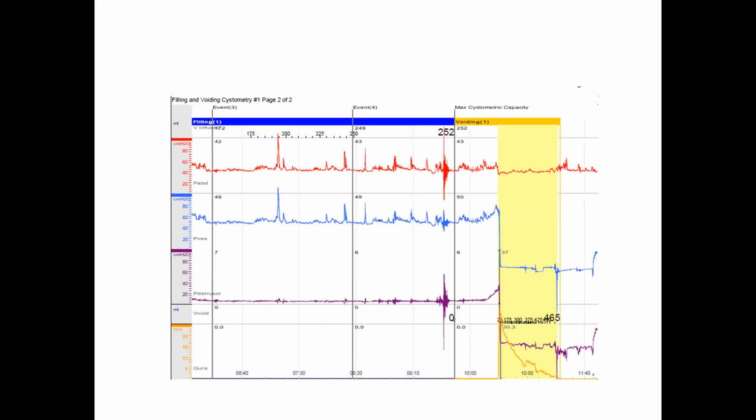It's also interestingly the point at which the flow starts, indicating that maybe the catheter size you used was too large and forming a slight obstruction, making it difficult for this patient to void past. You've identified the issue, the vesicle line has fallen out. Now, do you need to do anything?